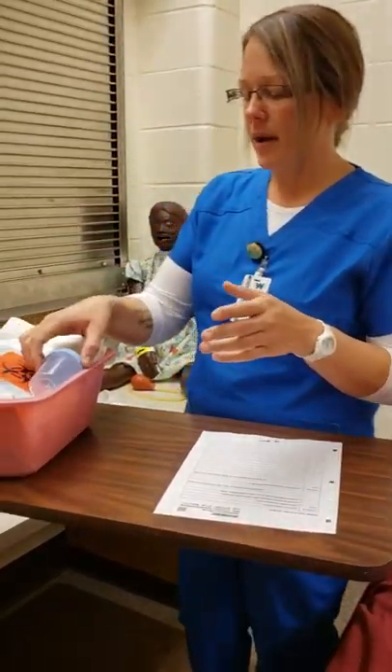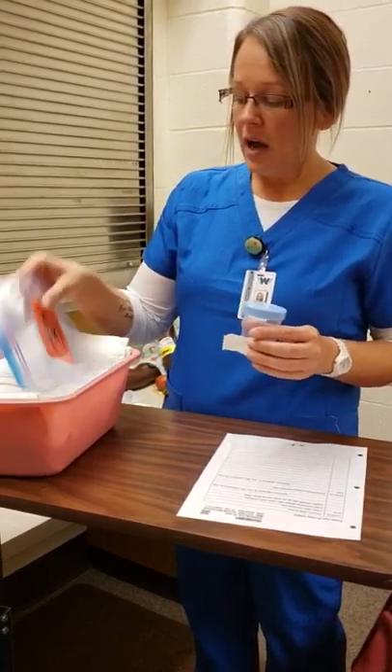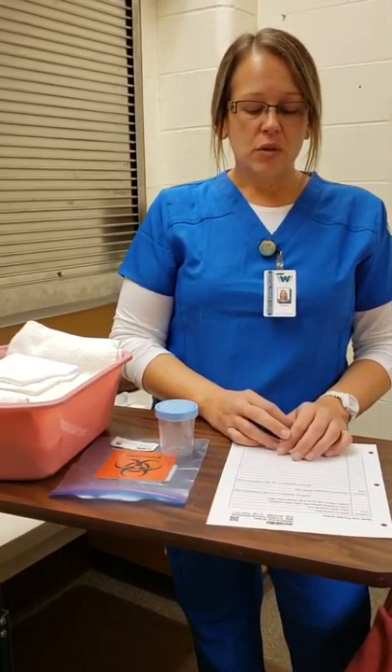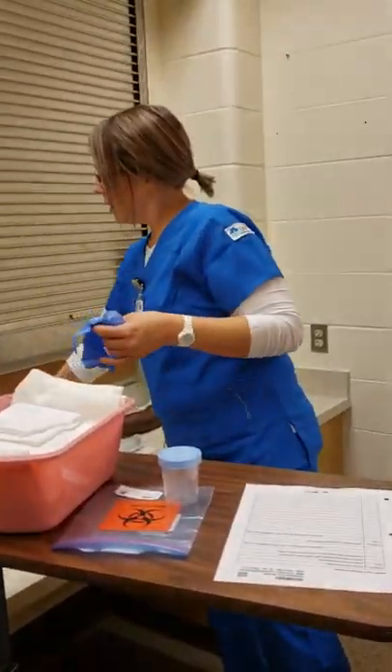So I have all my supplies for my clean catch urine: a sterile cup, a label, and my biohazard bag. Since my patient is female, I'm going to verbalize to her that she will bring the sterile cup to the bathroom and use three wipes going front to back — outer labia, inner labia, and the urethral meatus, all wiped downward.